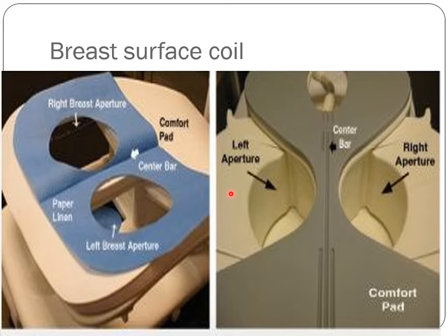And when you are buying an MRI machine, this is one of the things you need to pay attention to, because some companies and some engineers take advantage of that. They sell you a 12 channel MRI machine with 4 channel coils. You don't know, okay? And you lose all the advantages of your nice MRI machine because your coil has a low channel number. So you need to make sure the number of channels in the coil is as high as possible, considering the number of channels in the MRI machine. Get it?